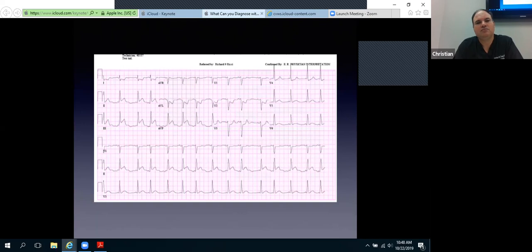Had they done a CTA prior to and know that they had a dissection? No, they saw the EKG and went to the cath lab, probably. Right. We did a chest X-ray on this patient because we'd intubated, put a central line, and done stuff. This was on a weekend night, so it took a little while for cath lab to come in, but not much. And the chest X-ray was normal.